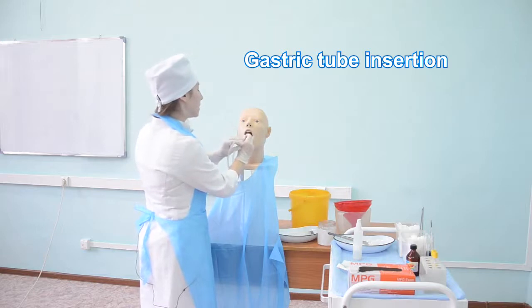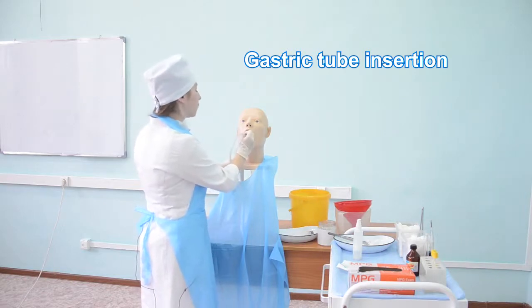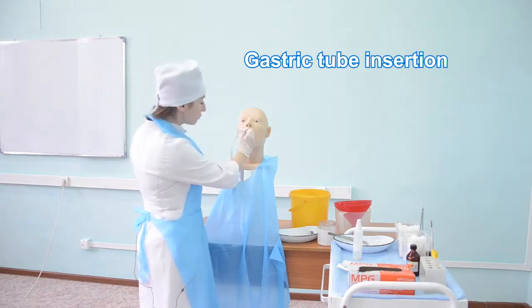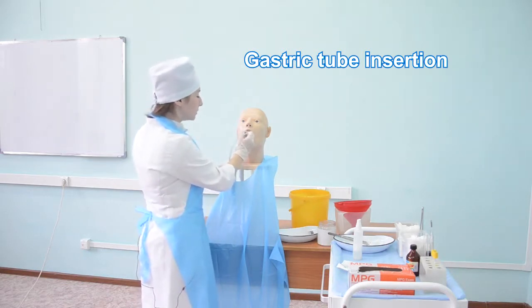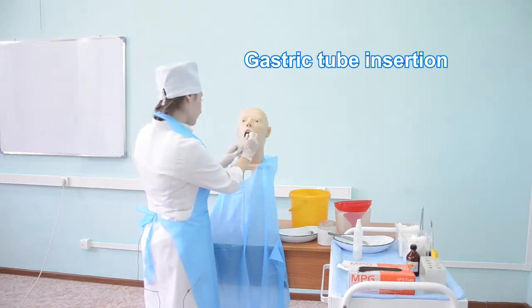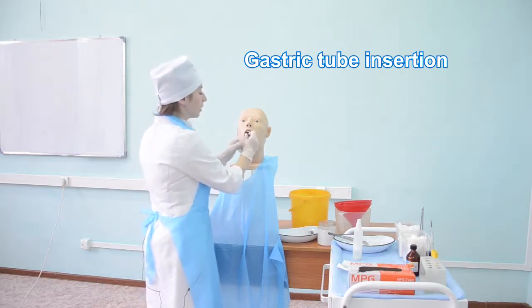Gently pass the tube down. If the patient feels cough, breathing difficulties, or the face turns cyanotic, remove the tube and try again later. If the patient feels retching, stop the procedure and offer the patient to take some deep inhales through the nose, then continue. Pass the tube down to the mark.